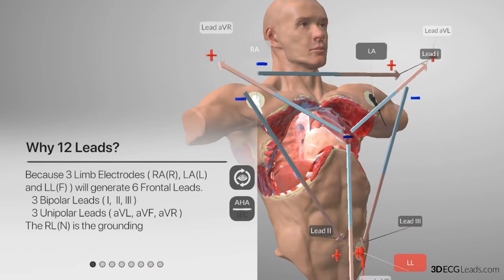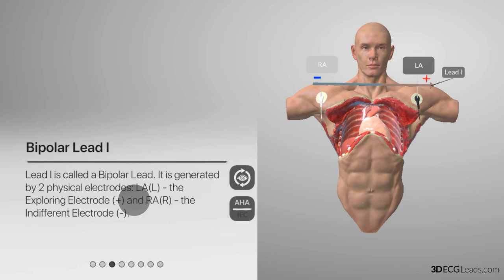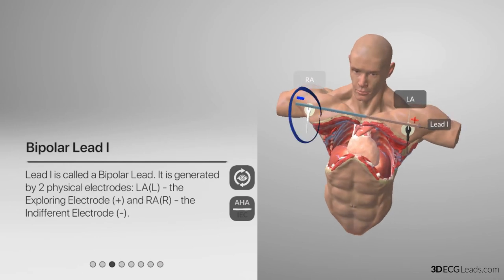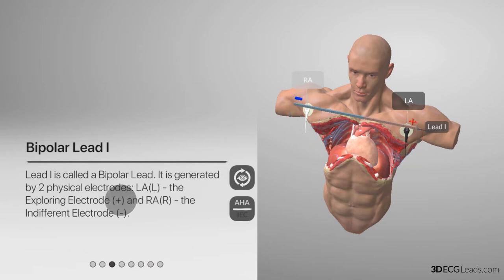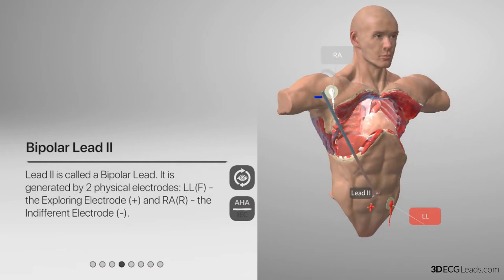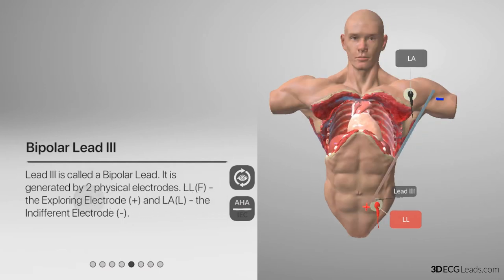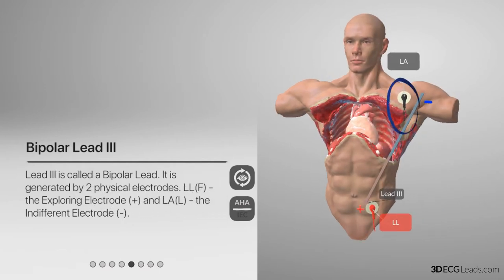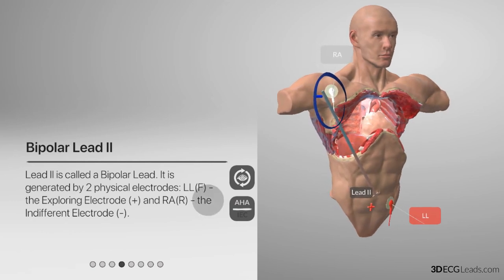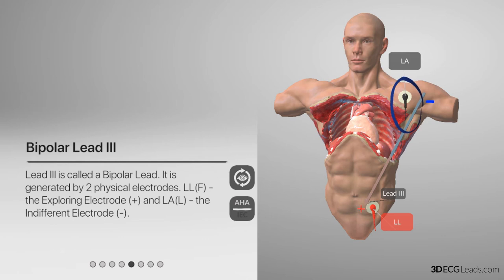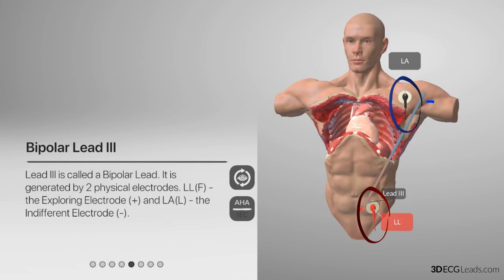Now let us look at all the frontal tracing leads one by one. Tracing lead 1 has the right arm electrode lead as the negative electrode and the left arm electrode lead as the positive electrode. Tracing lead 2 has the right arm electrode lead as the negative electrode and the left leg electrode as the positive electrode. Tracing lead 3 has the left arm electrode as the negative electrode and the left leg electrode as the positive electrode. Focusing on the negative electrode, we can see that as we move between leads, the positive electrode can remain the same while only the negative electrode's position changes — and with it, the lead's orientation.